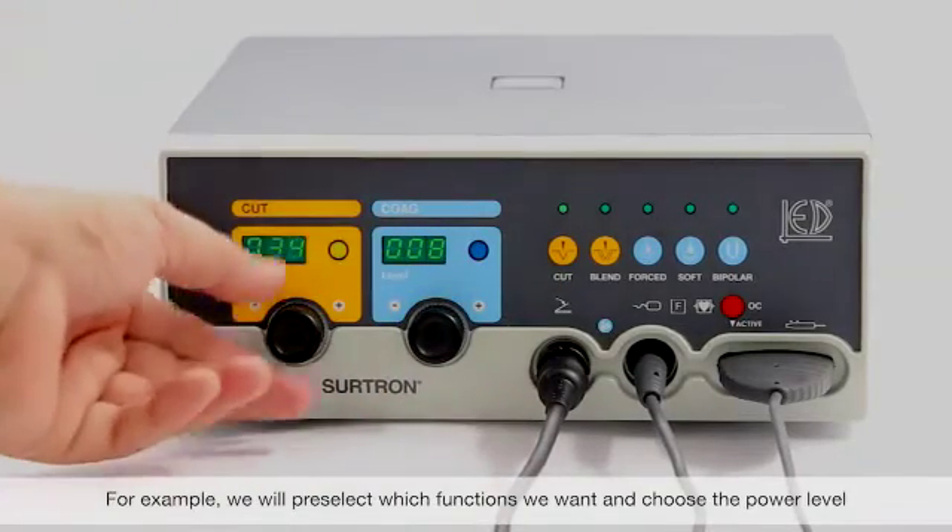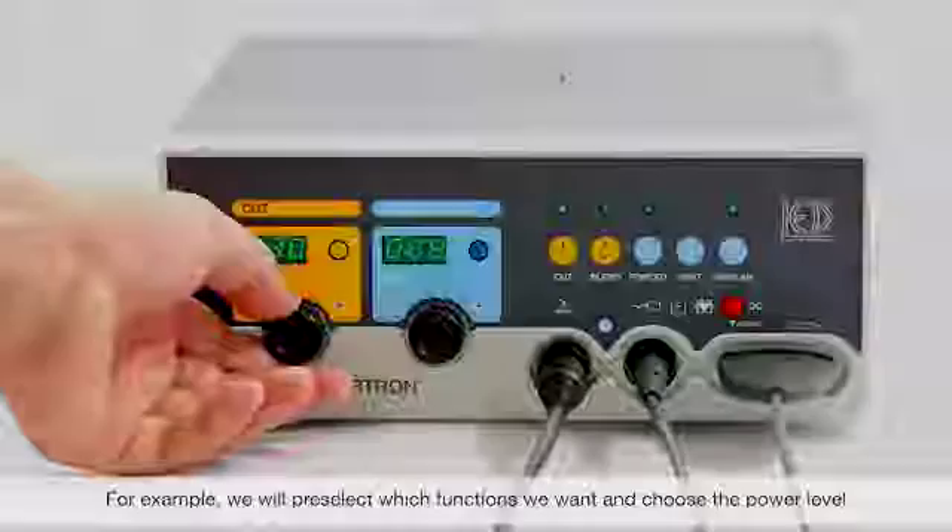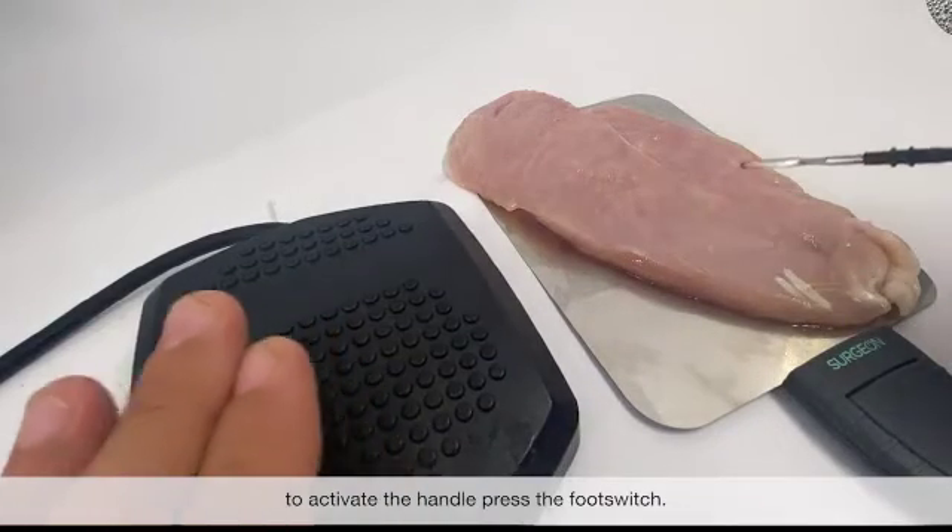We will pre-select the functions we want and choose the power level. To activate the handle, press the foot switch.